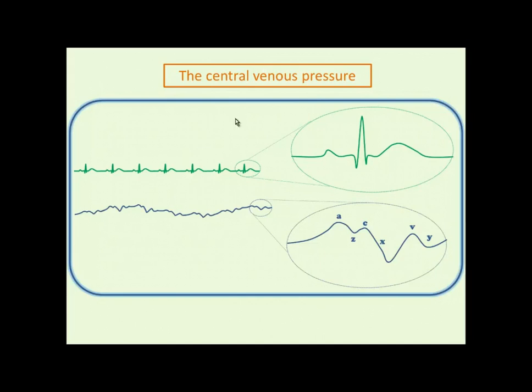All right, I talked too much about the CVP tracings already, so what do I want to talk about now? The deflection, the true CVP, the true end diastolic pressure we talked about, corresponds with the onset of the QRS. So this portion here is systole. Remember, systole ends at the apex or the pinnacle of the V wave, and it begins at the Z point. And during systole, this is where you would see tricuspid regurgitation in the tall V wave.